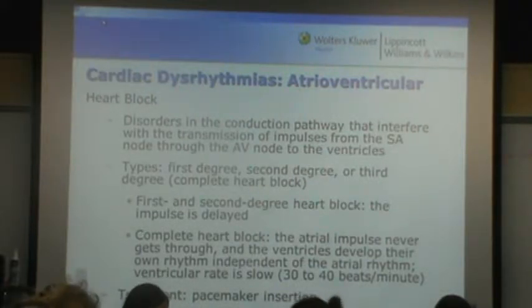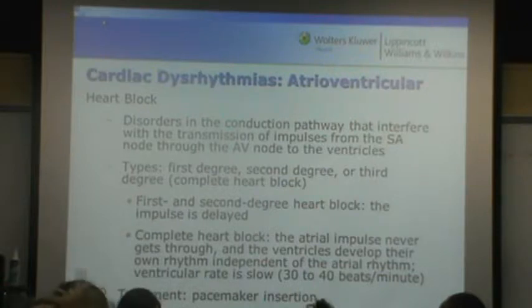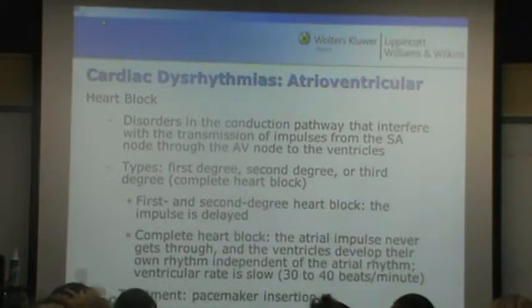That's the thing about a 2-to-1: it's kind of hard to realize it's atrial flutter because a lot of times what we think is a T wave is actually that first P wave. So yeah, and that's what that went through. Because I remember, like, wait a minute, the SVT did not show that. So yeah, that would be atrial flutter.